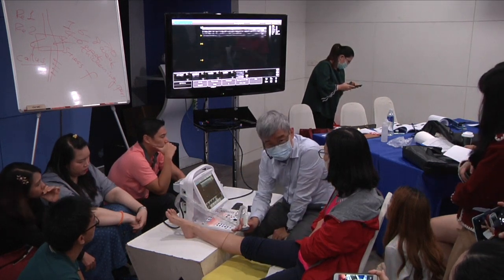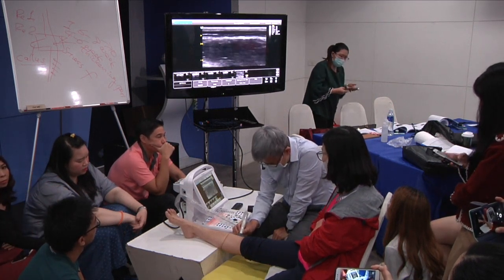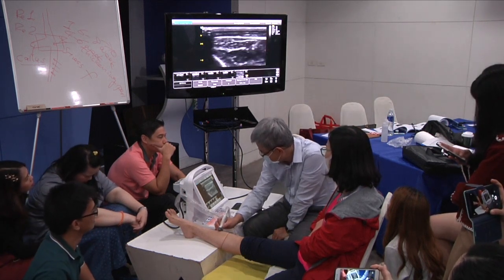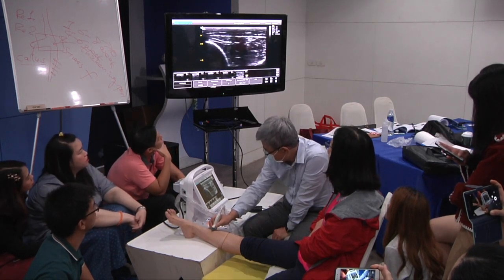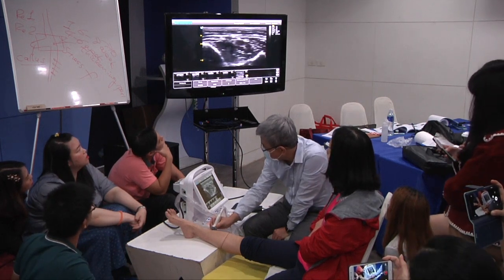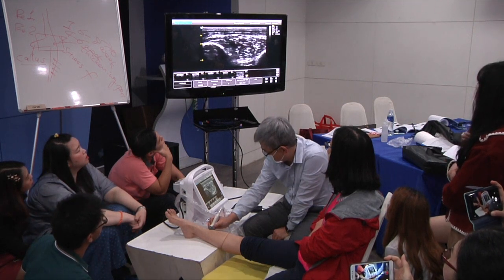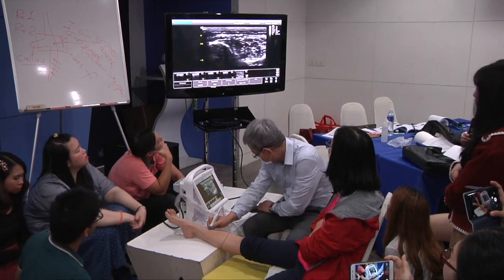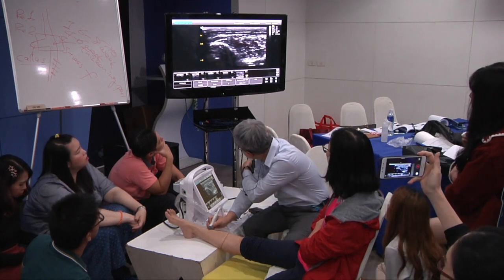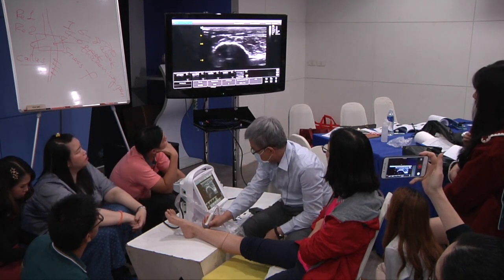I think you know there is Amazon coffee downstairs, right? If you have big problems with this, I think everyone deserves a coffee. Cool. Go. Okay. Don't worry. Tibialis anterior tendons. Extensor hallucis longus tendons. Right, they were high school friends before. TA, extensor hallucis longus. Oh, good, good, good. Go.